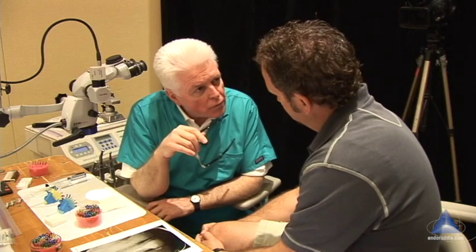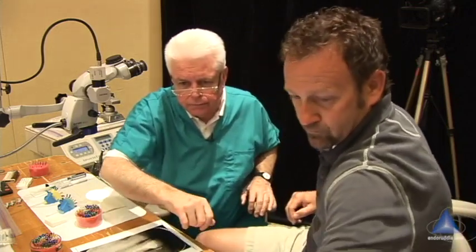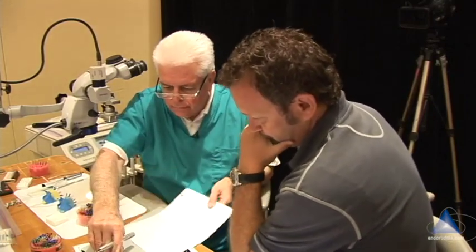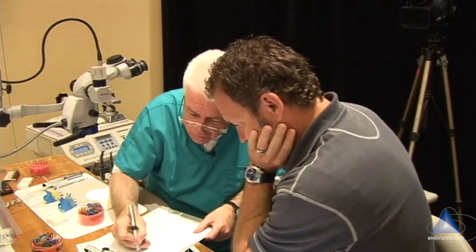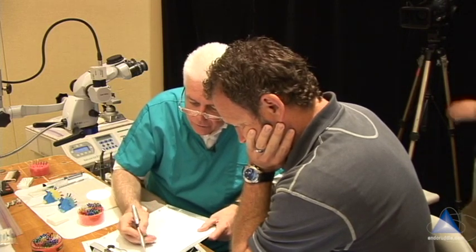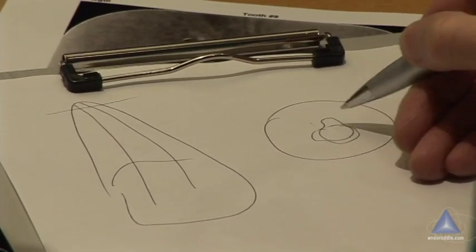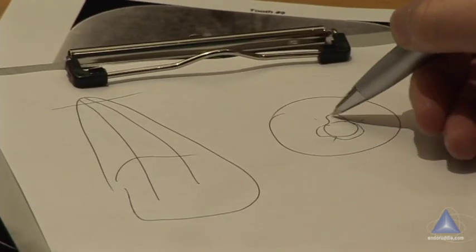I'm thinking you're not getting your gutta percha warmed well. Let me draw a tooth. You've got your final shape, and if we do a cross-section and look right at the end of the root, you could have a foramen that looks irregular. So you fit your cone like this — you might have contact points here and here, but there are discrepancies between the theoretically round cone and an irregular-shaped foramen.